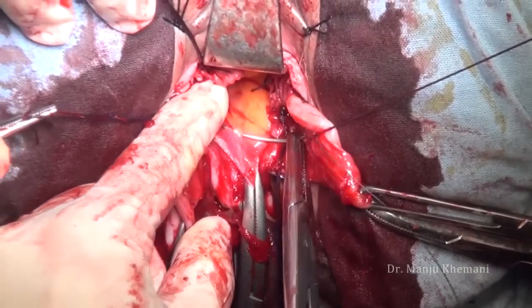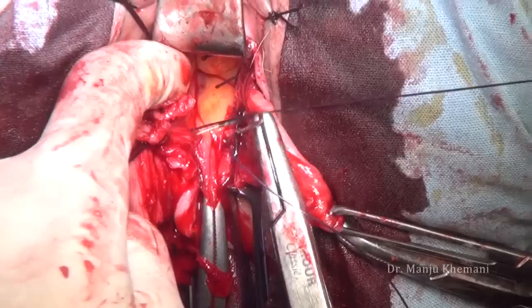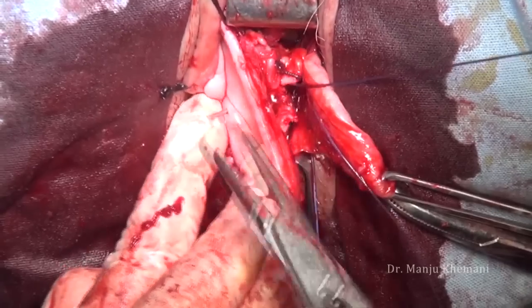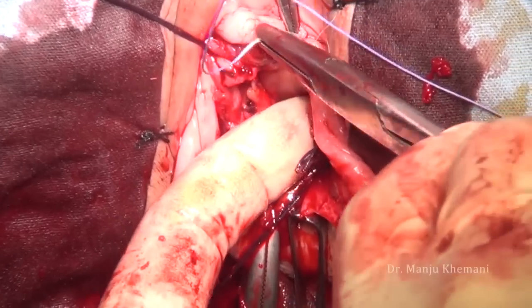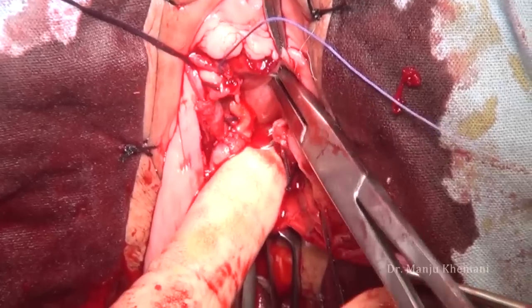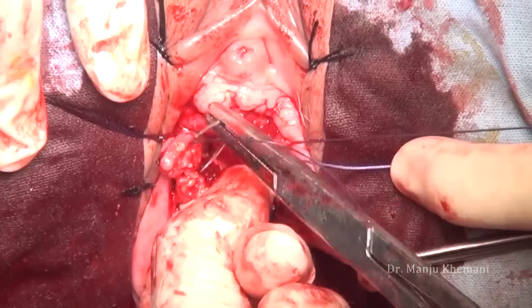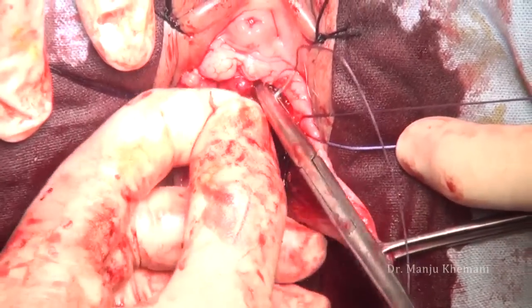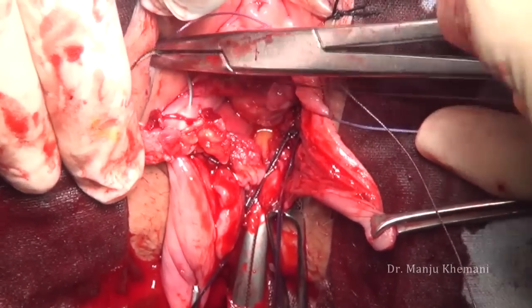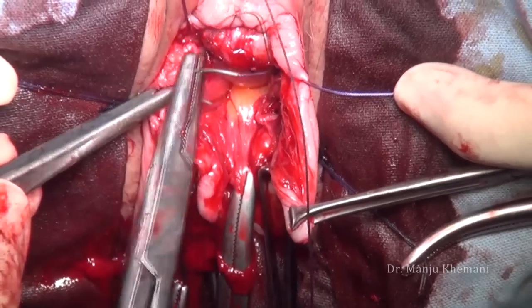Fat belongs to the intestine, so that's why we are below that. I have now taken a bite in the uterosacral on the opposite side and out from the vagina. I do not tie this suture yet — it is just held — because if you tie it at this moment, the cystocele repair will be difficult. After this I close the peritoneum so that all my pedicles are exterior; in case of any bleeding I do not have to open the peritoneum. This also gives a good buttress to the posterior surface of the bladder.